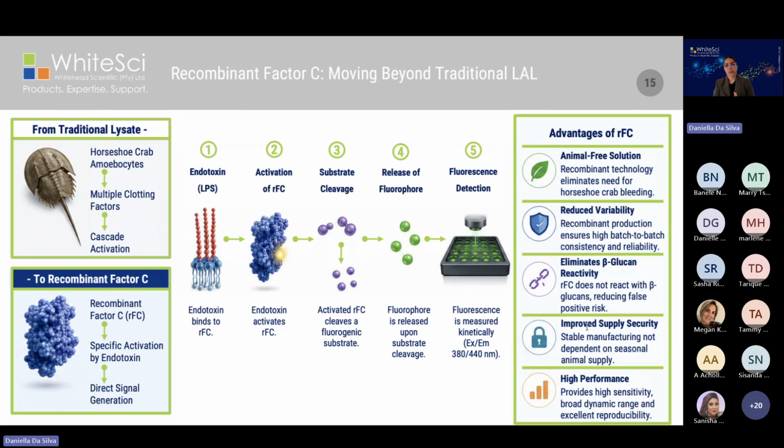In addition, recombinant technology supports the long-term supply stability and sustainability initiatives that are occurring within this field, and it maintains the sensitivity required for routine endotoxin testing. As a result, many laboratories are now evaluating RFC as part of both current and perhaps even future endotoxin testing strategies.